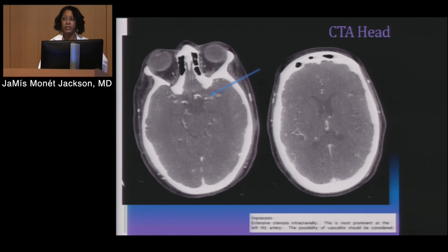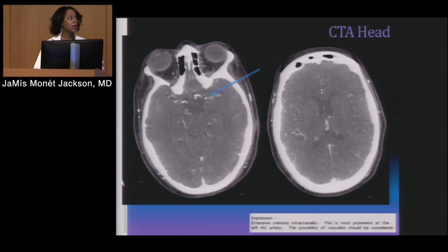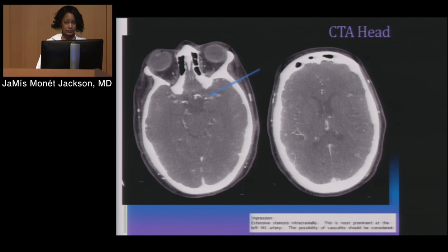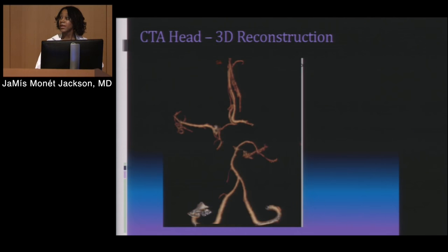Her vessels, for her age — and she's only a couple of years older than me — are very small and broken up. When you see a CTA, you should see the flow go through all those vessels cleanly. Unfortunately, in this patient, we don't see that.